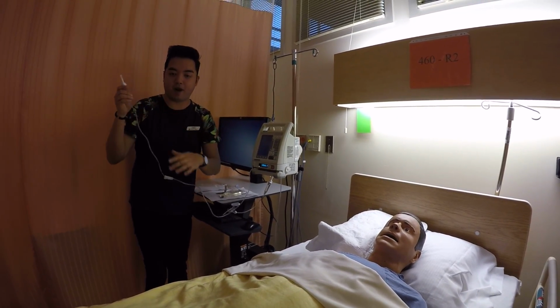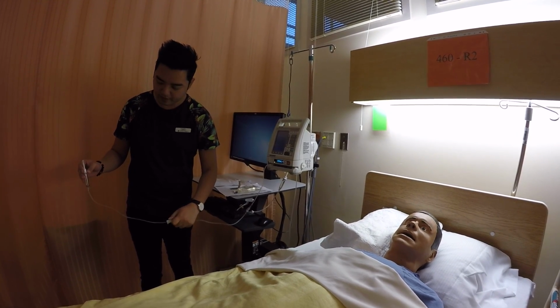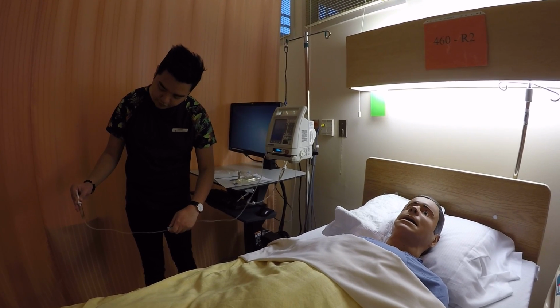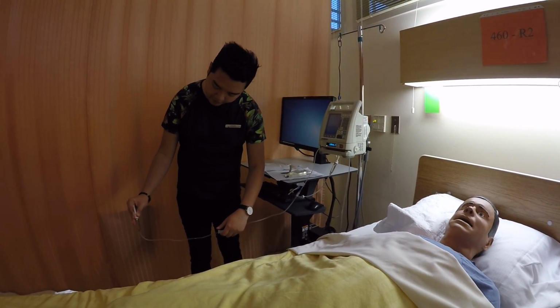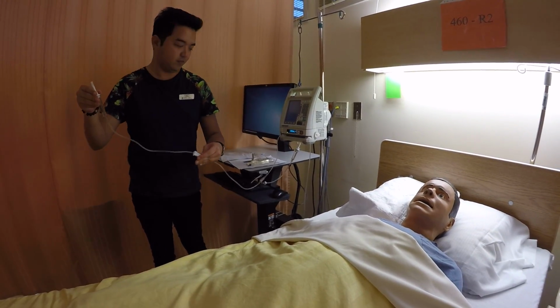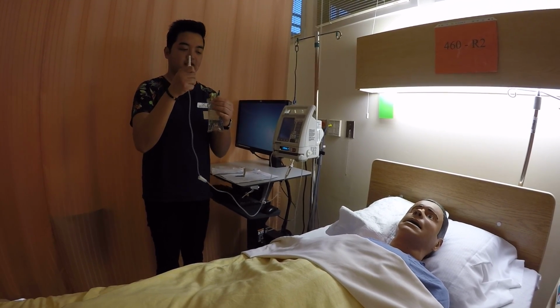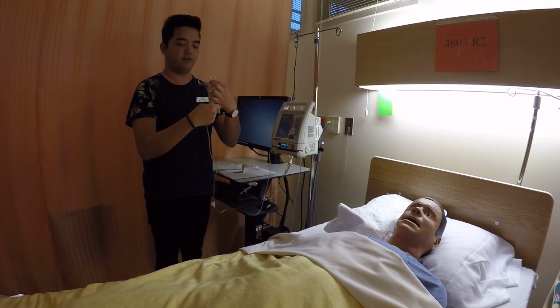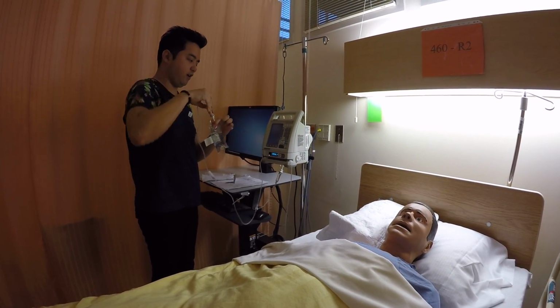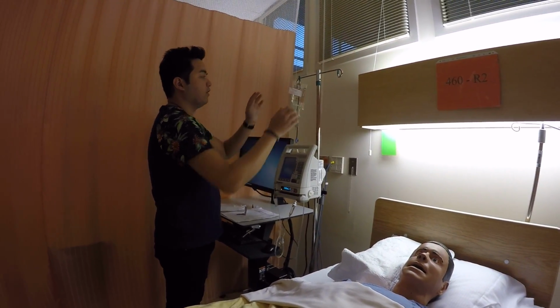And then now we're ready to back prime. So to back prime, we just slowly release the clamp. And then just make sure that we fill at least 1/3 to 2/4 of the chamber. Okay, there you go. Then we just clamp it again. Now we're ready to spike. So this end is clear and this end is sterile as well. So we just remove that one. Okay, and then we can now directly spike. There you go. Okay, and now we're ready to set.